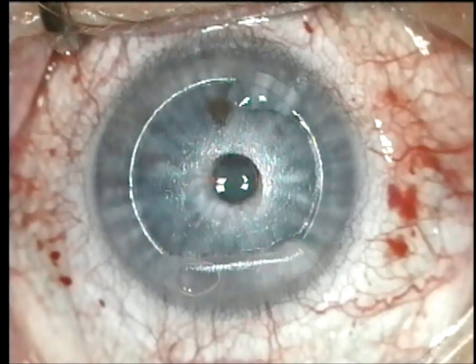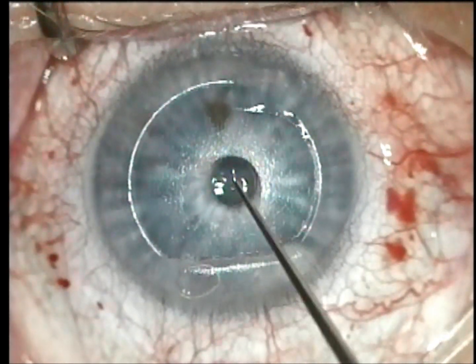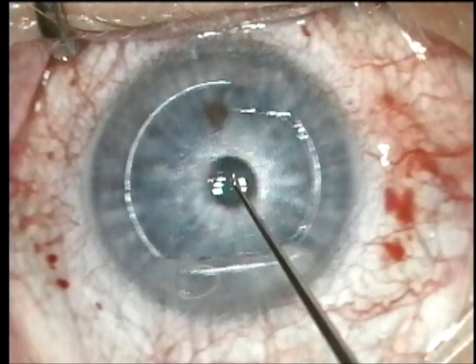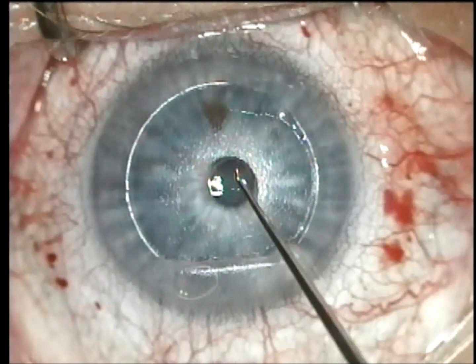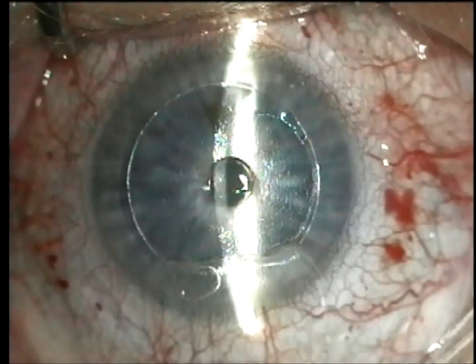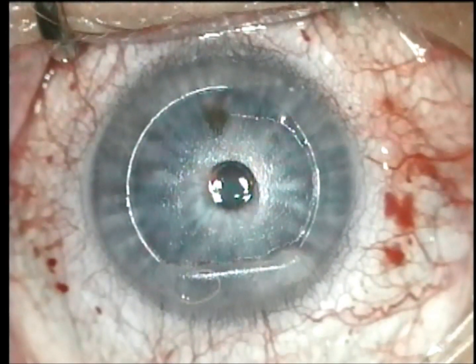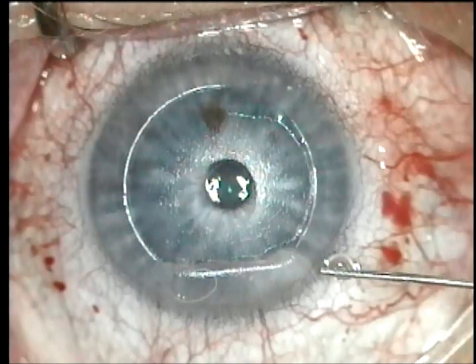Again, you see me wetting the stromal side of the flap. I'm going to make sure the inlay, while it's still moist, is well centered. You can push or pull pretty well while it's still moist. You want it generally in the center — it's not critical that it's exactly in the center. That's one of the beautiful things about the raindrop inlay.